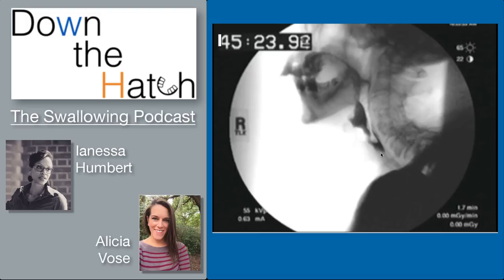Considering where the bolus position is in the pharynx when the swallow is initiated is an important factor — not necessarily blaming the bolus, but keeping in mind where that position is. Once the swallow started, the bolus was right there. It could be that this pattern of starting the swallow with the bolus in the piriform, which has been documented in healthy older adults, was this person's baseline behavior before the stroke. But now that the stroke has happened, it puts this person at greater risk.